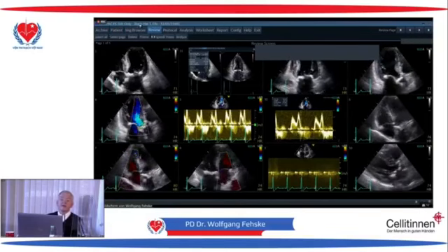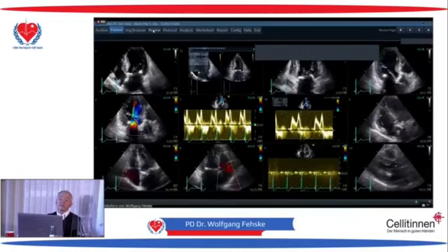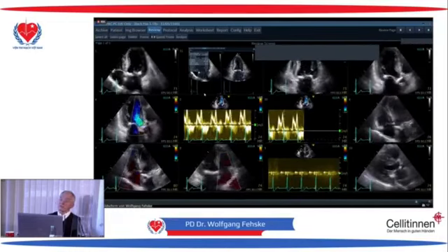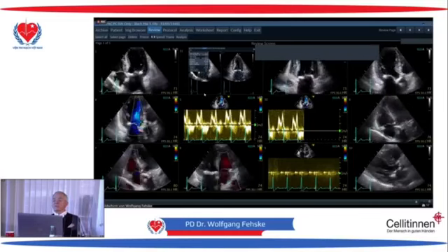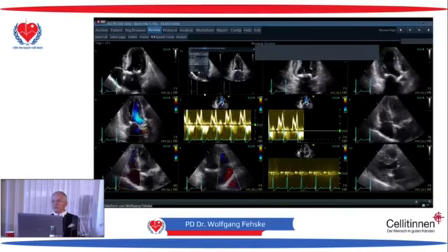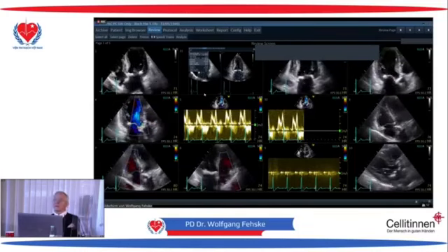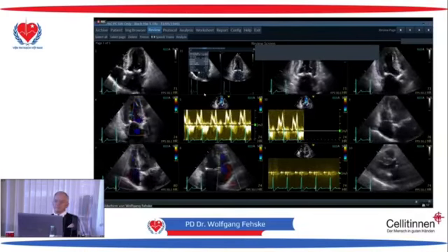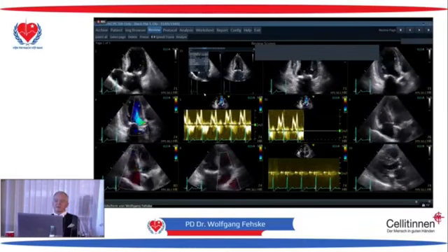This is a lady of 71 years. We heard today aortic stenosis should all be treated with TAVIs, but I'm in a surgical department now, and I have shown you some concerns about taking everybody to TAVI because there are some restrictions, and one of these restrictions is the calcium in the mitral valve. Can you explain? This patient has aortic stenosis, that is obvious.